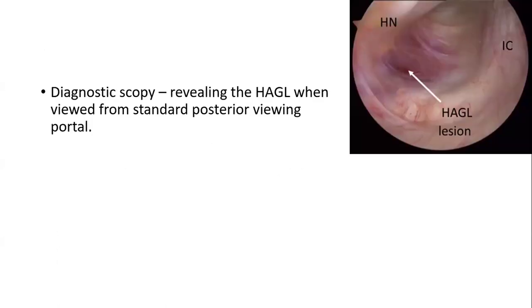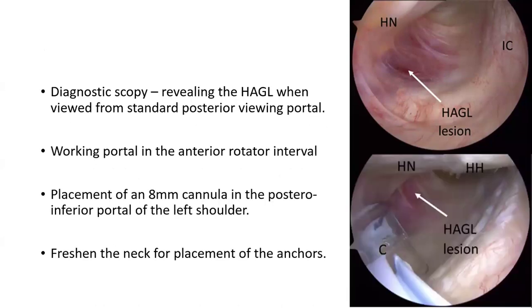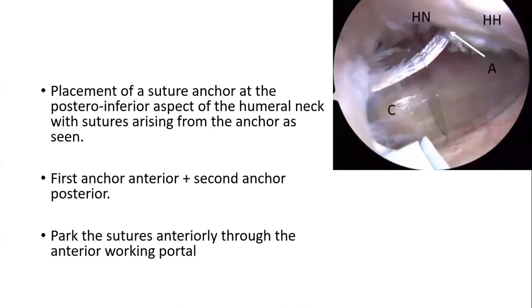Now, just a very brief step-by-step. First, you start off with the diagnostic scopy, go to the HAGL area, and if there is a HAGL, as seen in the image here, you establish a posterior inferior portal and you push in an 8.25 self-retaining cannula over there. So this gives you access to the HAGL attachment site. You can see that HN denotes humeral neck. That is where you want to ideally seat the anchor. And that is where you will decorticate, freshen the bed, and place the anchor.